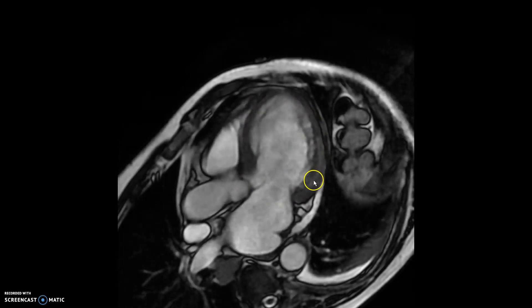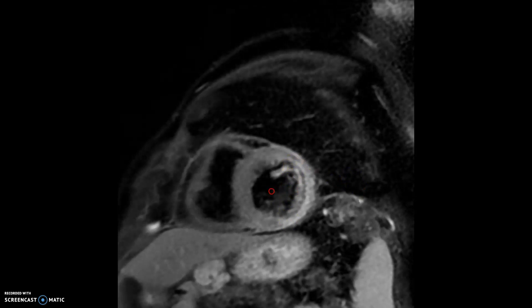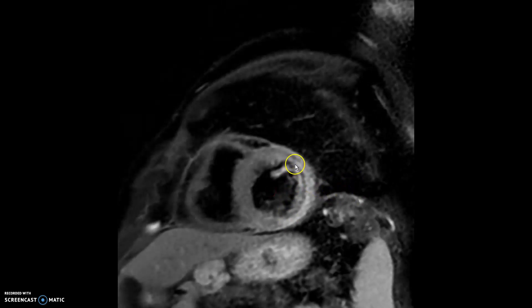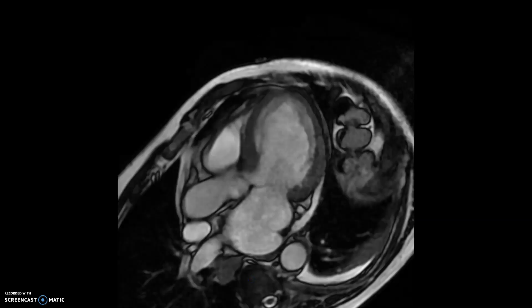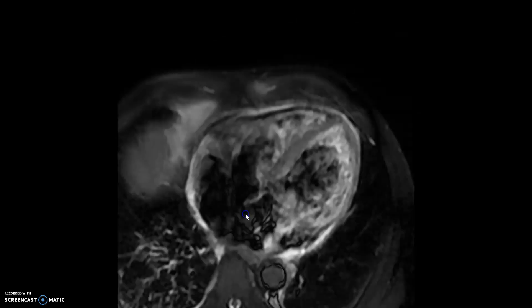On the three-chamber view, you similarly see the same findings. If you come to the STIR images or the T2 images, as you can see, there's increased enhancement on the anterolateral wall because of edema. However, there's a mid-segment where you cannot see any enhancement — this is microvascular obstruction. You can also see that there's pericardial enhancement.